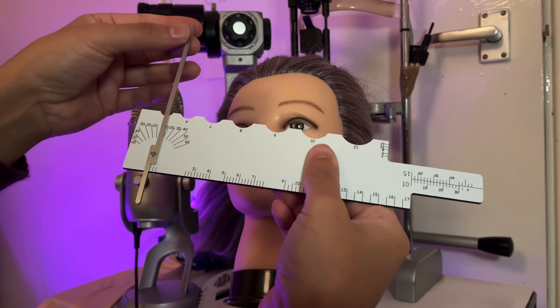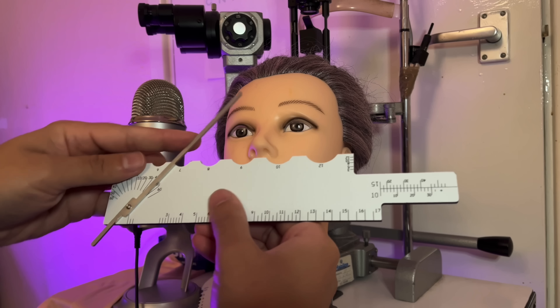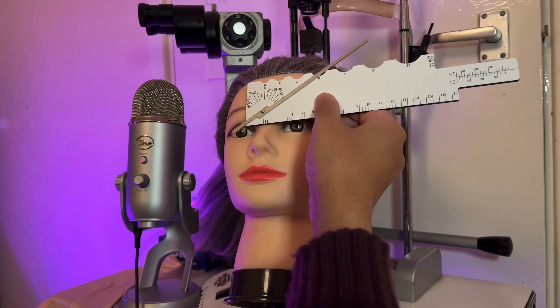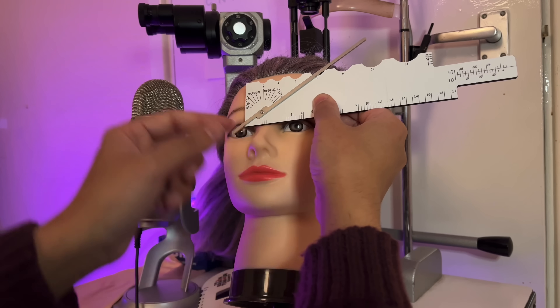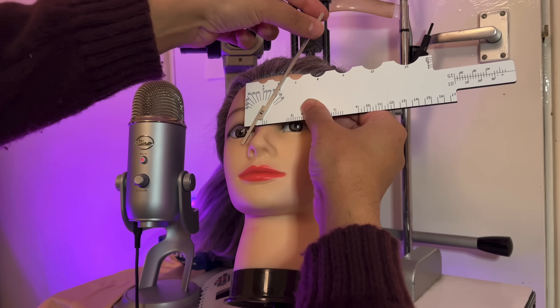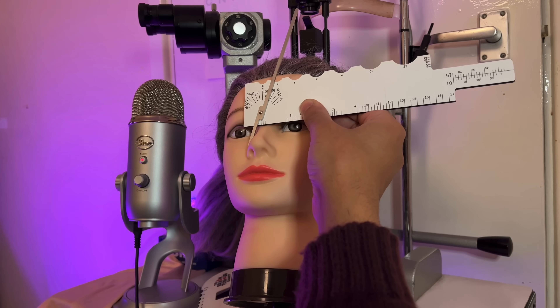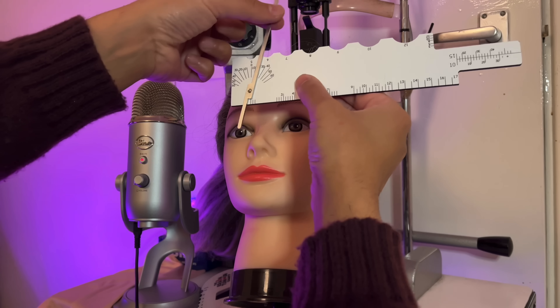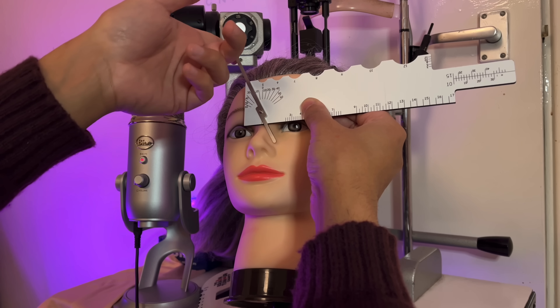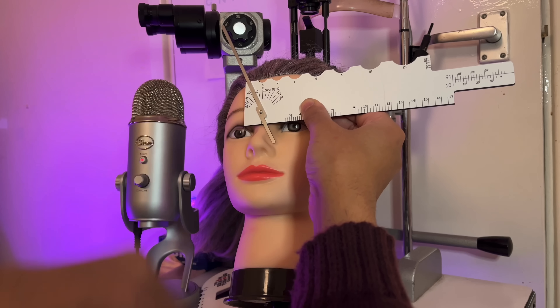Let's use the scale here for the front angle. The largest part will align with the center of the nose. Bring the cursor down steady until we have contact and take the measurement off the scale. Easy to do the other side — just move the cursor, slide to contact, and read off the scale there. Excellent.